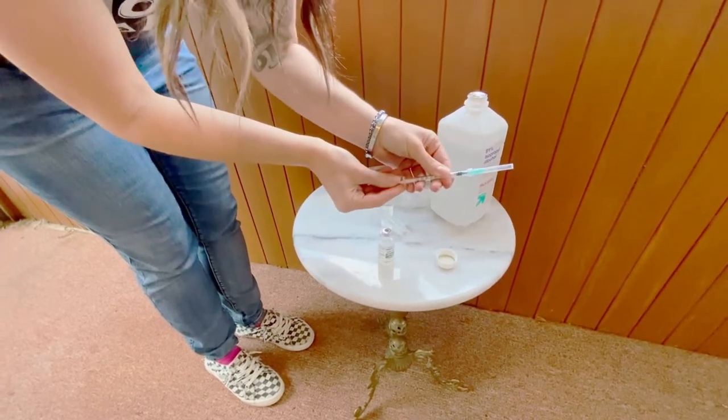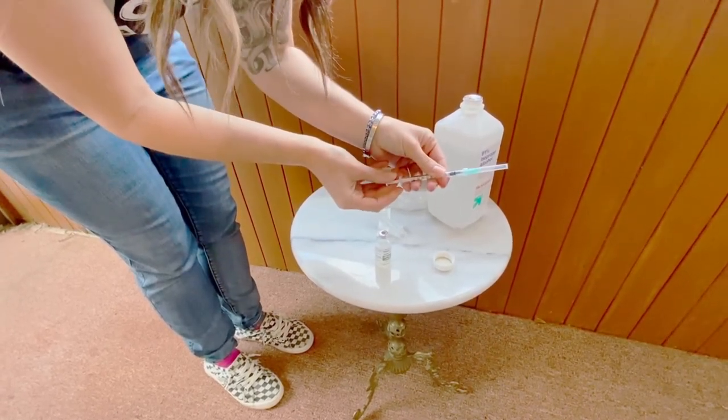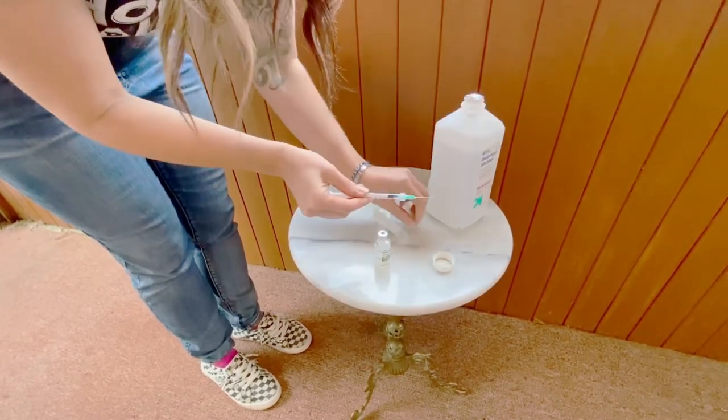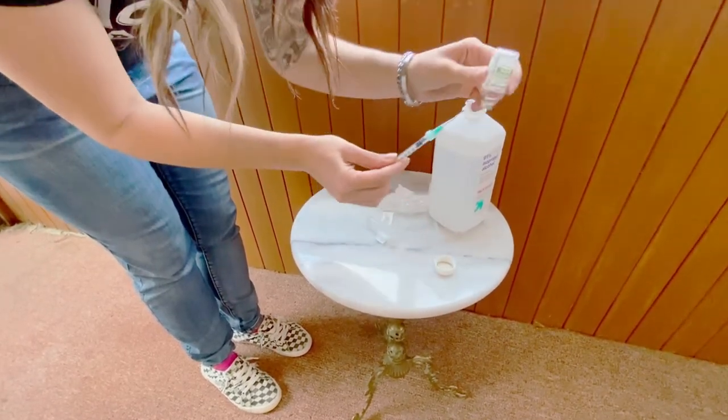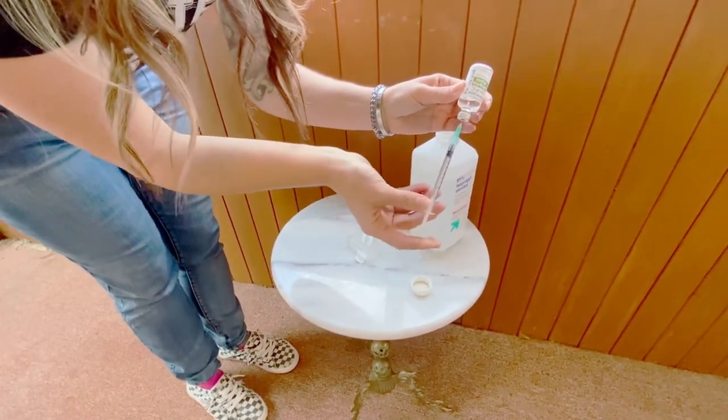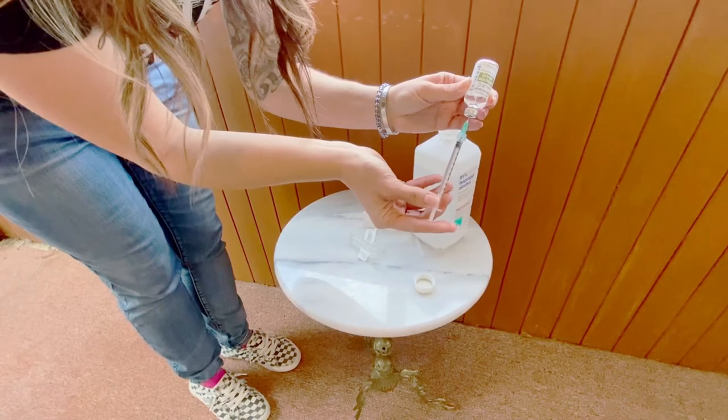First you'll pull back enough air to where your injection dose is going to be. Pop off the cap, invert your vial, introduce the needle into the testosterone and then plunge the air into the vial.